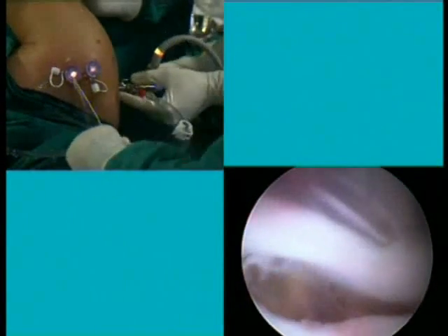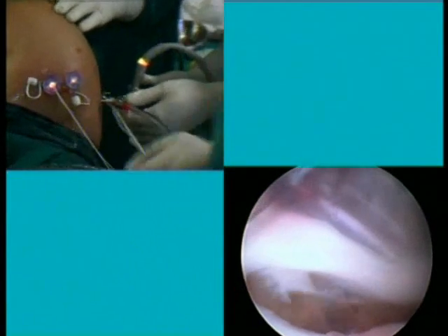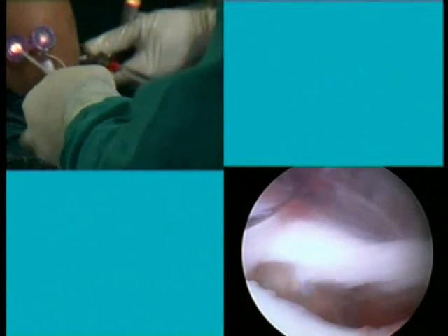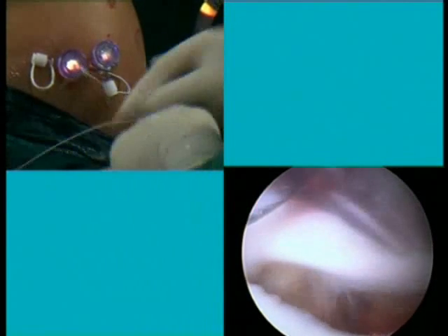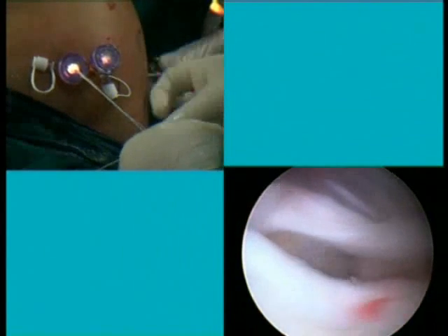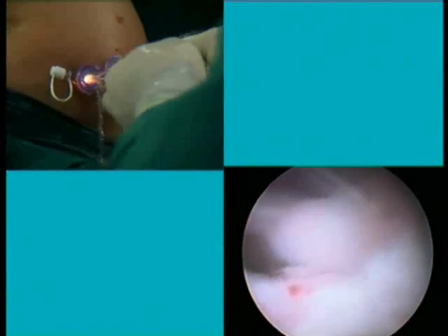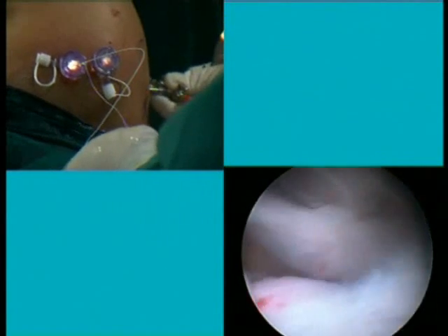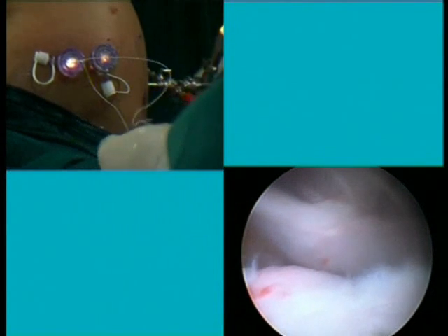Yes. So I'm going to try a knot if the cameraman can focus here, and it is sliding well, as you can see. There are 2 passes here, as you know, and 1 more, and then I'm ready to slide. Because of the transmission, there is less light here, but there you go.